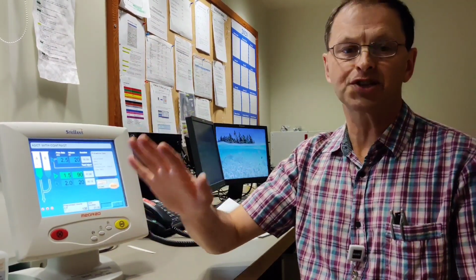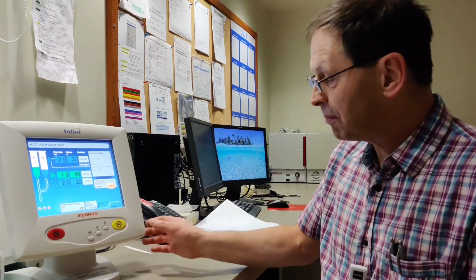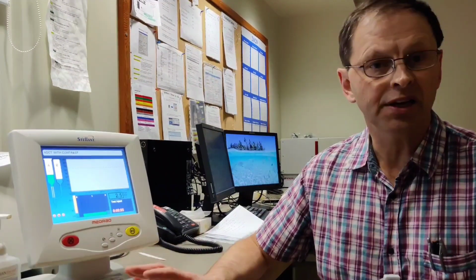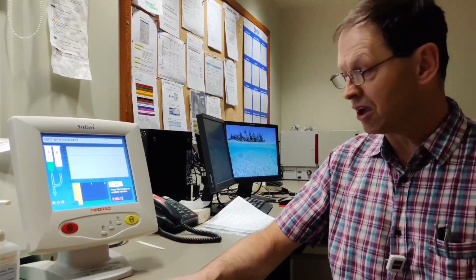So the first thing, assuming that we've followed all our other protocols, patient's ready to go, we've done our pilots, or just prior to doing our pilots, we need to do that test injection. So I'm injecting that 20 mils of saline. Again, you would have somebody in the room ideally just confirming that the line is patent and that the patient's not in any discomfort, because that could be a sign that there's issues with the IV.